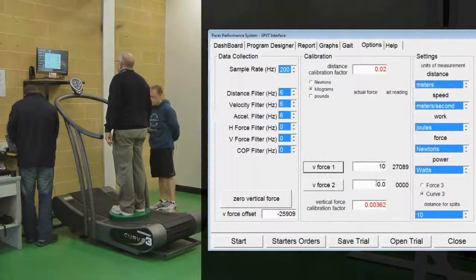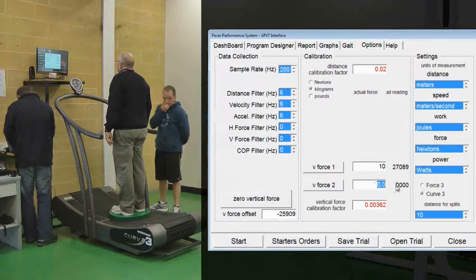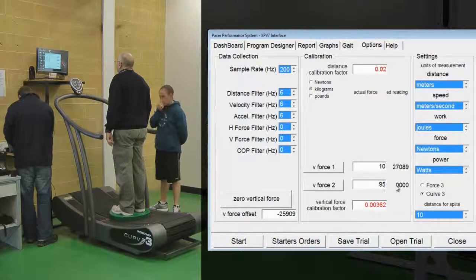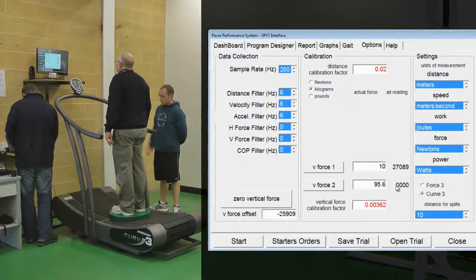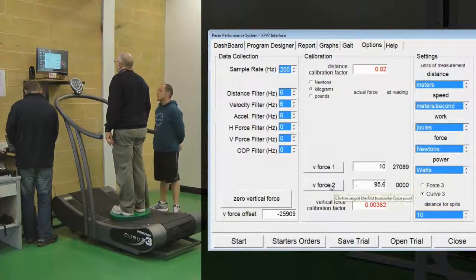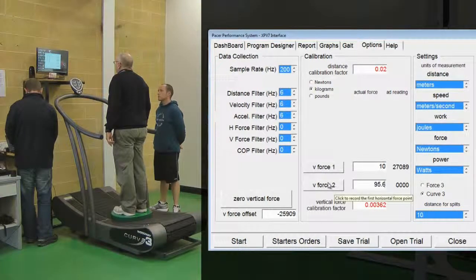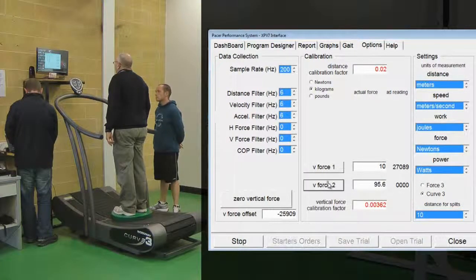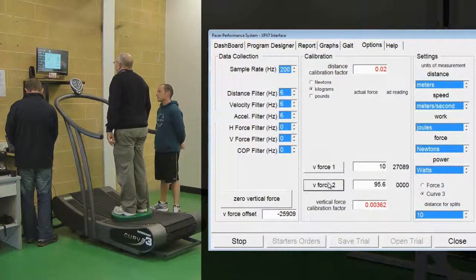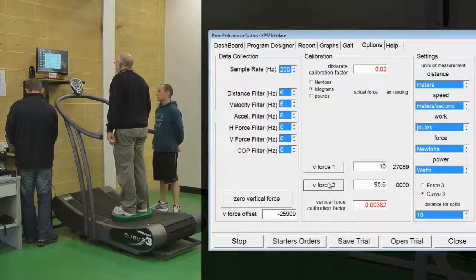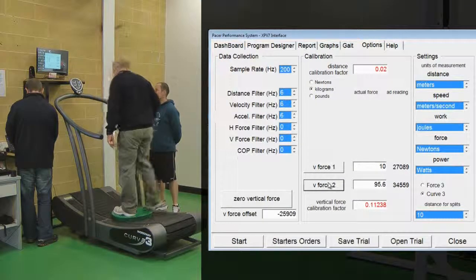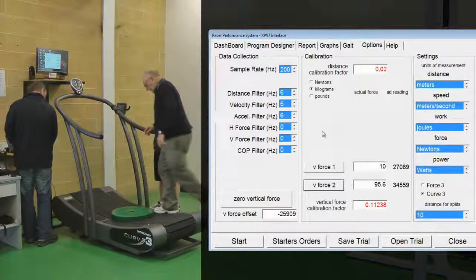We then get a known body mass to stand on the treadmill. In this case it is 85.6kg plus the 10kg of the weight, so 95.6kg. Click Vertical Force 2.